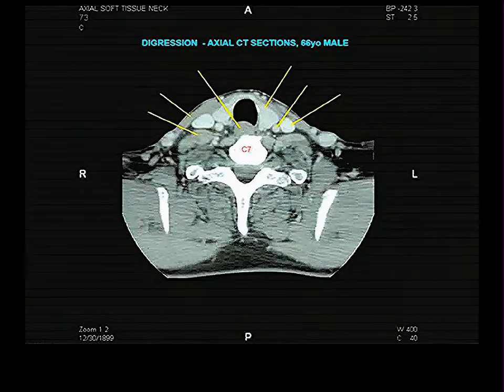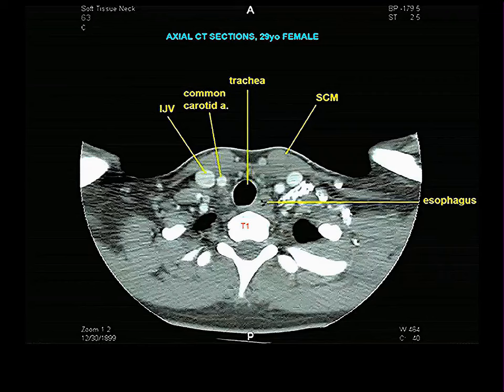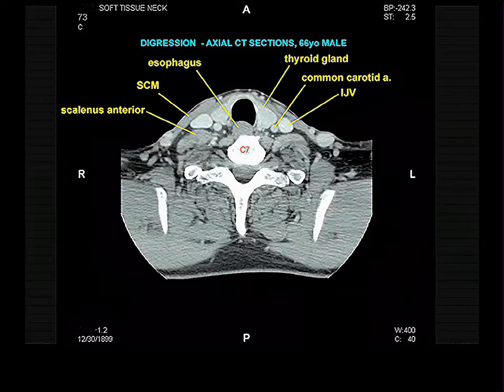And now we change to a different person. The different person was chosen because this is an older person whose cartilages are calcified, and you'll be able to see them well. Whereas if we had followed this, who is this? Do I give an age on this person? Yes. This is a 29-year-old woman. Her cartilages are not calcified. And as we went up the neck, we would have a hard time seeing the cricoid and a hard time seeing the thyroid. We'll come back to her later. But I switched to this older person where these things are not so hard to see.